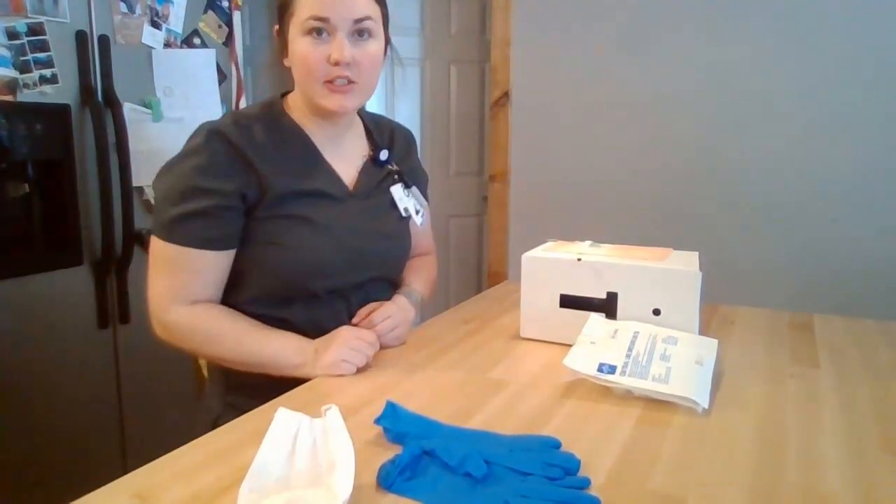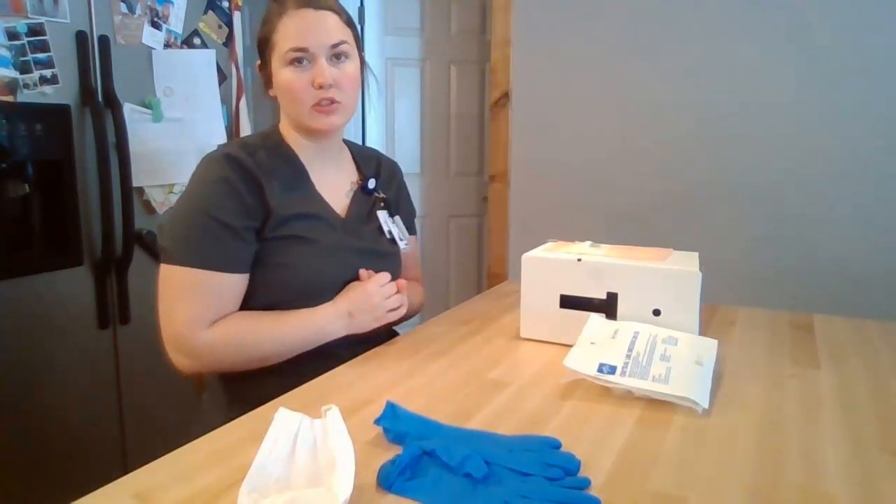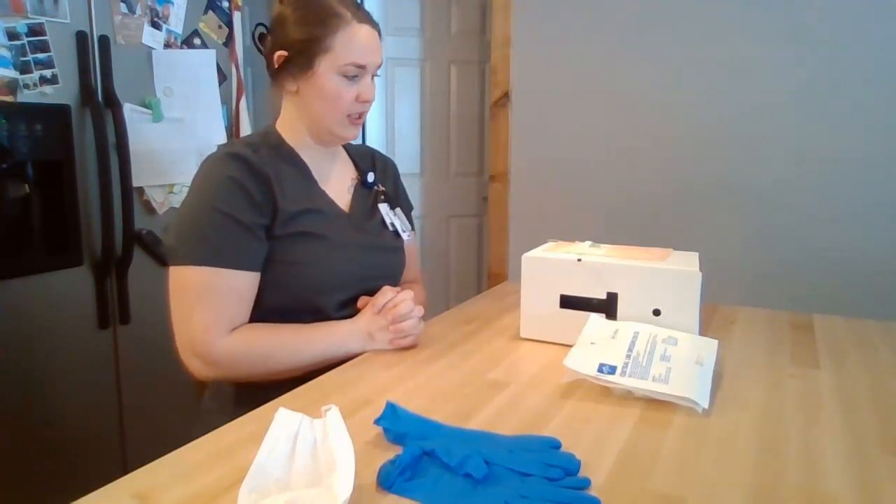Hi, my name is Alessandra Bice and I'm doing the Central Line Dressing Change Skills Remediation video. I'm going to start by performing hand hygiene and entering my patient's room, introducing myself as the nurse, and letting them know that I'm doing the Central Line Dressing Change.